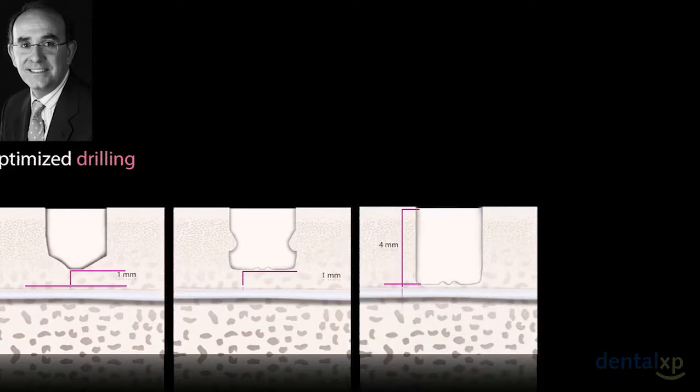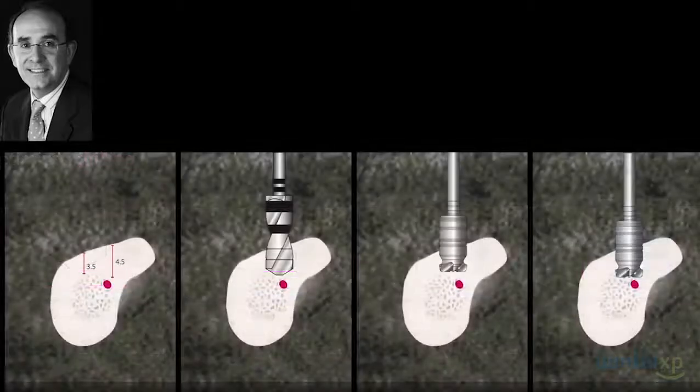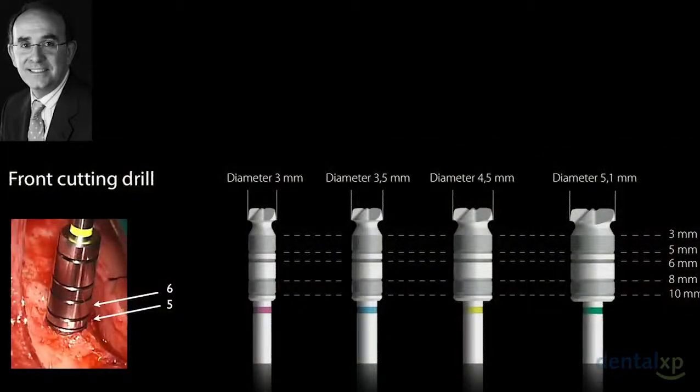Why? Because you drill carefully. The drill is flat, and you have perfect control. It doesn't make sense to use a stopper on the drill if you drill slowly, because you can see perfectly the lines of the drill. And after, you can place your implant. With this protocol, you can also drill carefully, and after, with the bone that you recover drilling, we can place our graft. Like I show you in this picture, it's very easy to observe the line of the drill during the drill protocol.